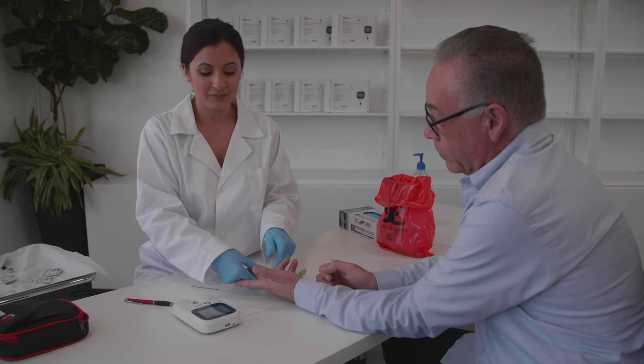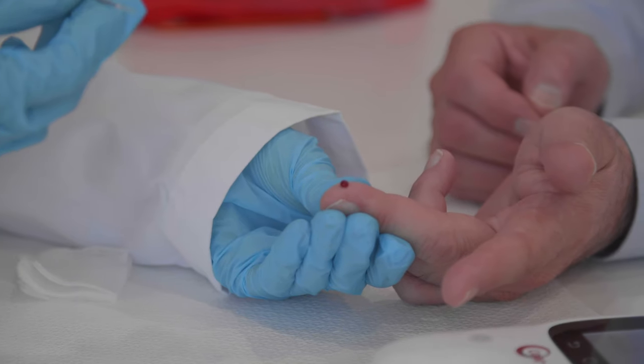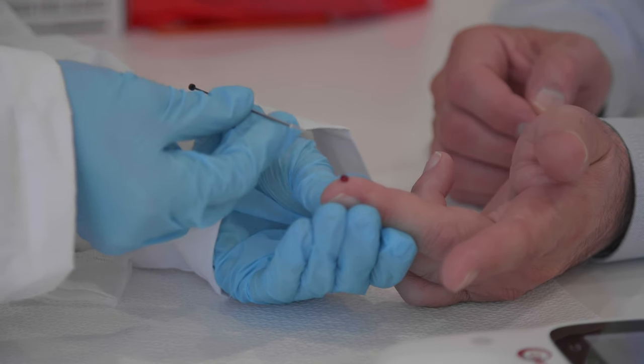A minimum of 10 microliters of collected blood sample is required. The finger stick site should bleed freely. If it doesn't, put pressure at the first finger joint, then gently squeeze the finger from the sides to get it started. Lowering the patient's hand and arm so that the fingertip is below the heart helps the blood drop form. Keep squeezing the finger until you produce a pea-sized bead of blood. Please note: squeezing the finger stick site excessively or milking releases interstitial tissue layer fluid containing tissue factors that can cause unreliable results.